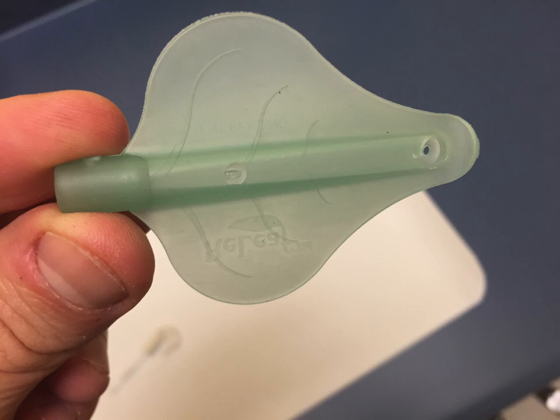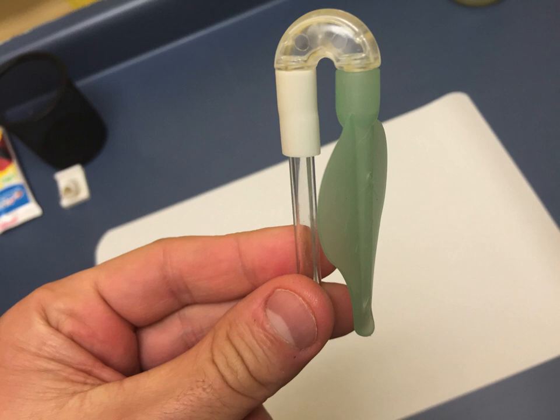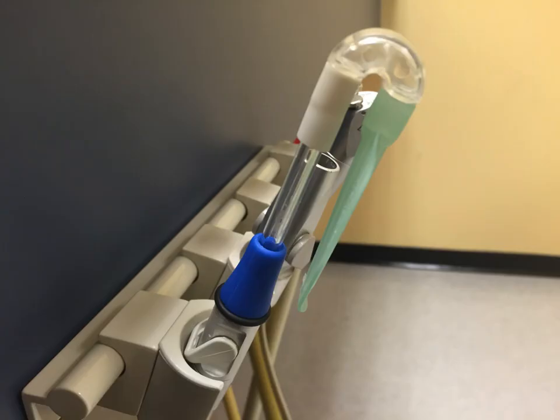Here it is all together, ready to go into your saliva ejector valve. The space between the plastic tubing and the green leaf is pretty tight — that's so it can slide onto the cheek and keep everything in place, which it does pretty well.